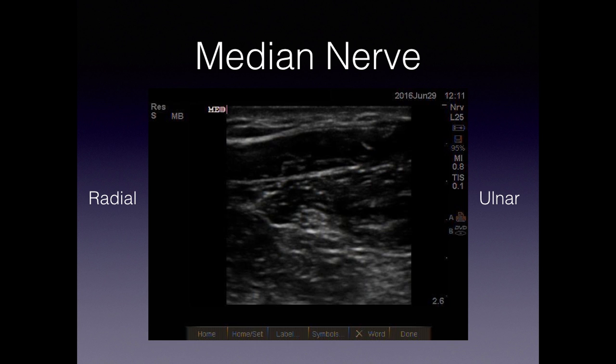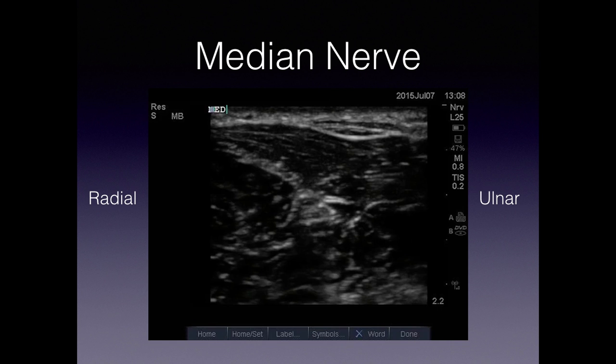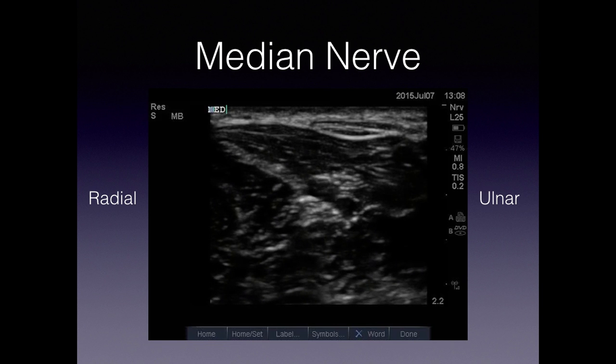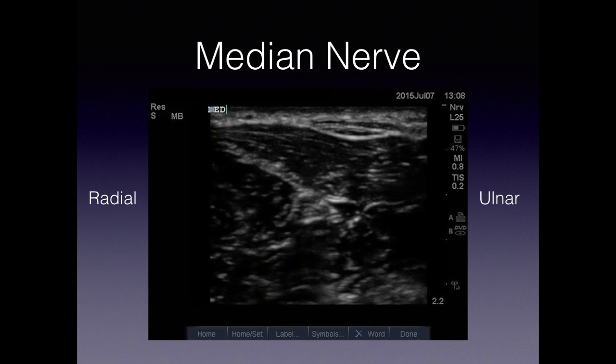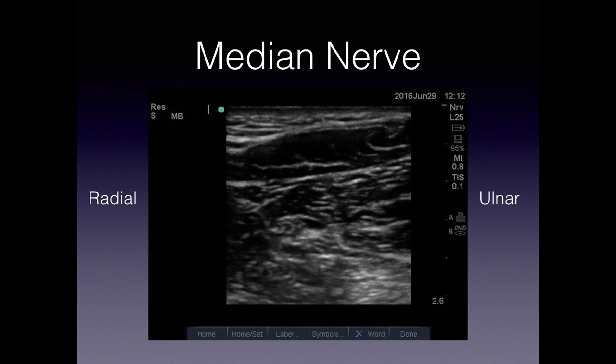The median nerve lives right in the middle of the flexor forearm. It's often more easily visualized in the middle of the wrist as opposed to the distal aspect. It's important to move up and down the wrist to find the spot where you can best see this hyperechoic honeycomb-like structure. For this procedure you would use the in-plane approach and can advance from the ulnar or the radial aspect, whichever is easier. Advance your needle toward it and start to inject your lidocaine. The lidocaine will start to envelop around the nerve and let it pop out from the fascial plane to give good anesthesia.